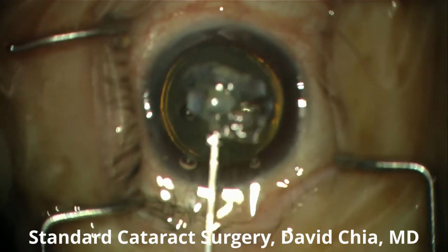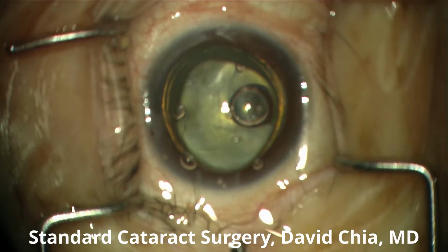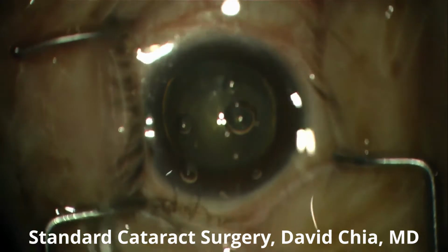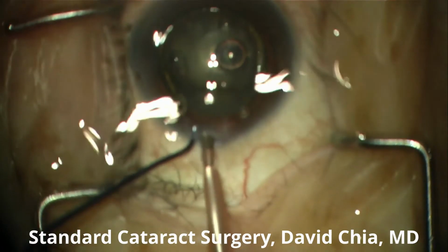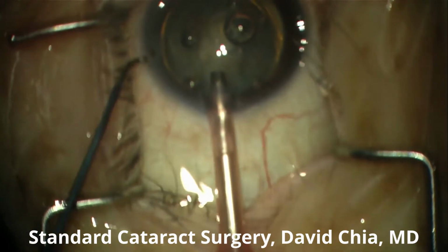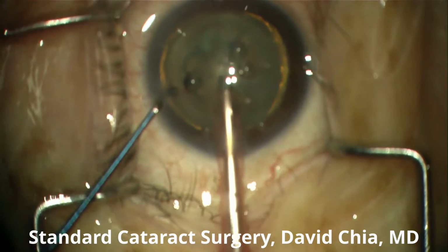Additional viscoelastic is then applied both inside as well as on top of the cornea. This will ensure that the cornea is well protected. Now we're inserting the phacoemulsification handpiece. And so this is placed in continuous irrigation. And this is moving at 40,000 times a second. So this is really what the phacoemulsification procedure is.